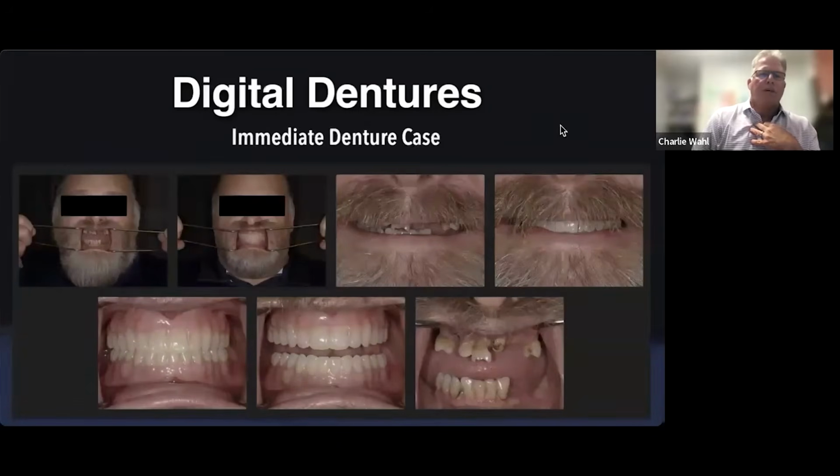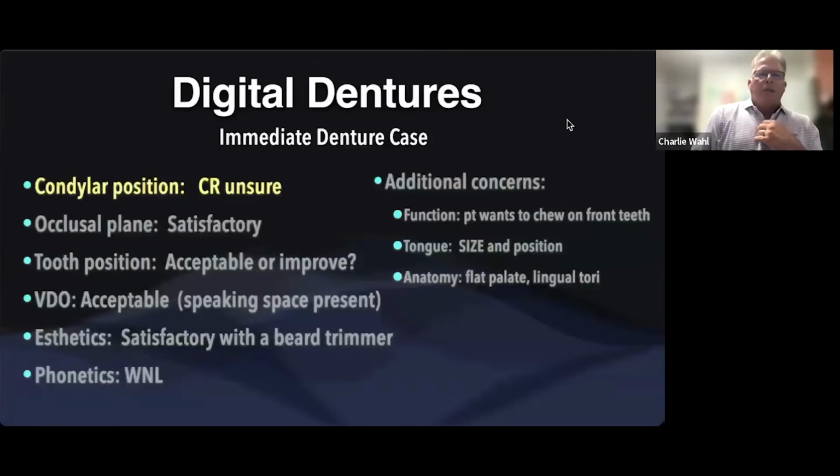And here he is, pre-op and post-op, day after extractions. So pretty drastic change, but the teeth fit, right? They're in the right spot. So we knew going in, this was not an easy patient. And so applying those analog principles, once again, whether it's analog or digital, we're going to take our removable principles and now we're going to be critical, right?